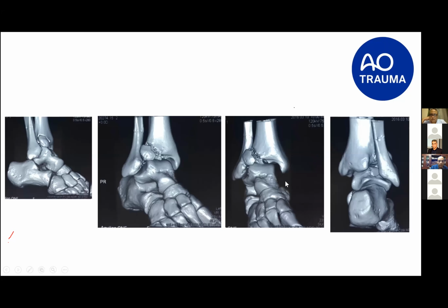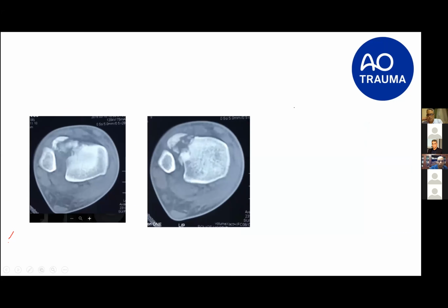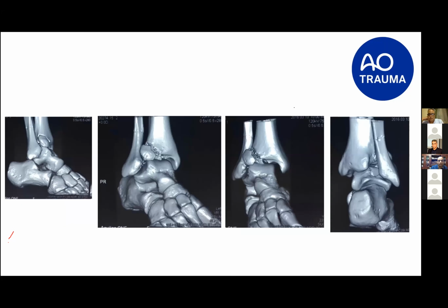And I think you said there is a fracture in the talus, right? So it needs to be fixed as well, I think. Yeah, this one. So this cap needs to be fixed with a headless screw or a rigid pin or something like that.